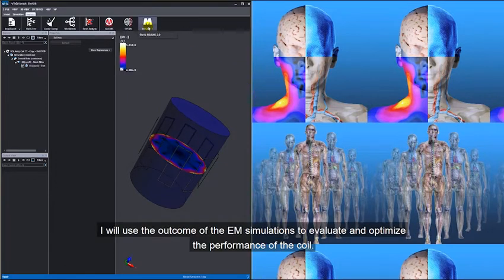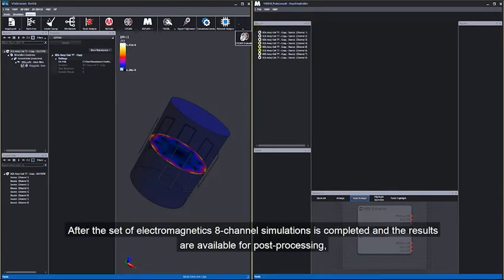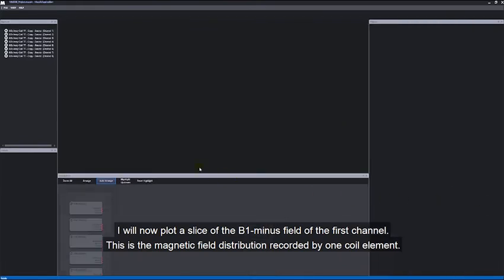I will use the outcome of the EM simulations to evaluate and optimize the performance of the coil. After the set of electromagnetic 8-channel simulations is completed and the results are available for post-processing, the simulated fields can be imported into Musaik and become available for further analysis. I will now plot a slice of the B1 minus field of the first channel. This is the magnetic field distribution recorded by one coil element.